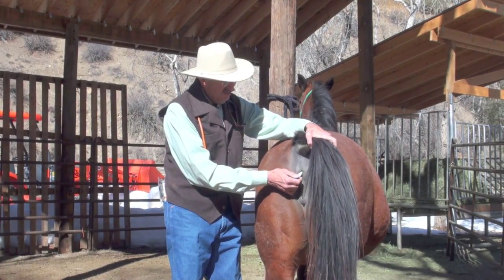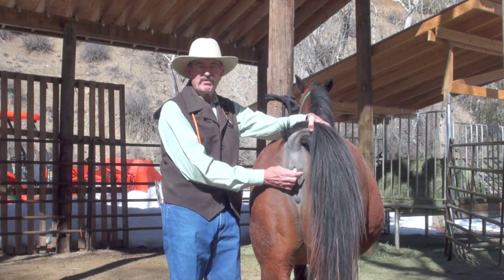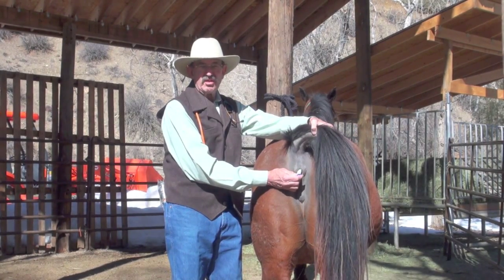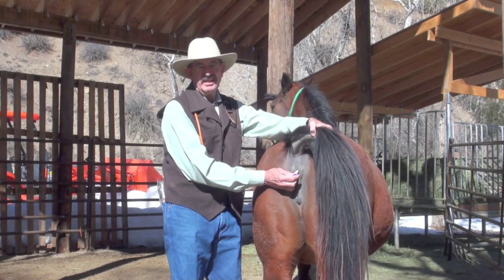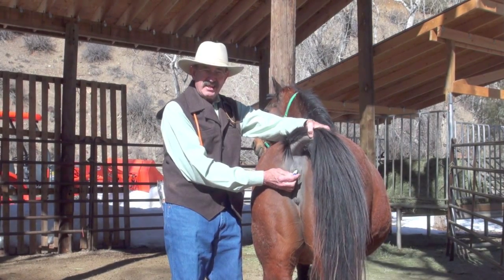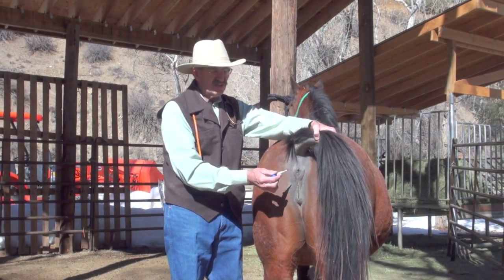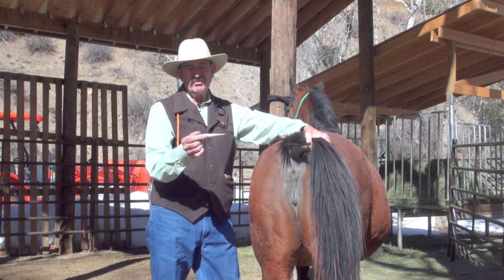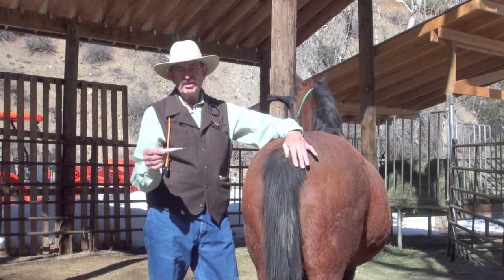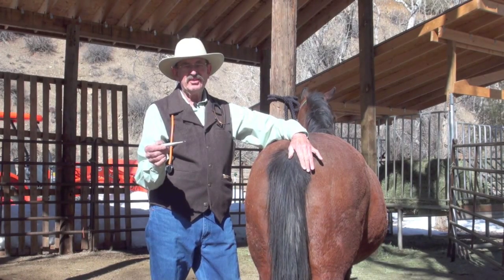Insert gently into the anus — you need to go in three or four inches, so you're talking about maybe half of the length of the thermometer. Turn the thermometer on. Typically these things will come on and tell you okay, which means that the thermometer is working well and that you've got battery. Hold it in place, and it will take only a few seconds to get a beeping noise. The beeping noise tells you that you've taken the temperature, and then read it. This mare is 99.9, which is perfectly normal. In most horses, 99 to 101 is within the normal range and perfectly acceptable in non-stress conditions.